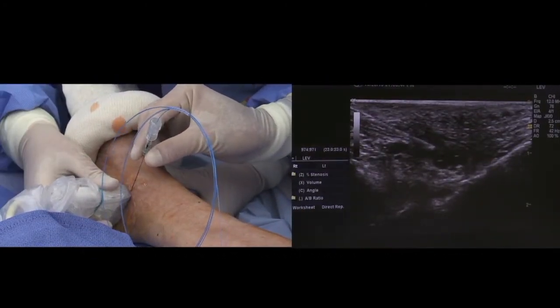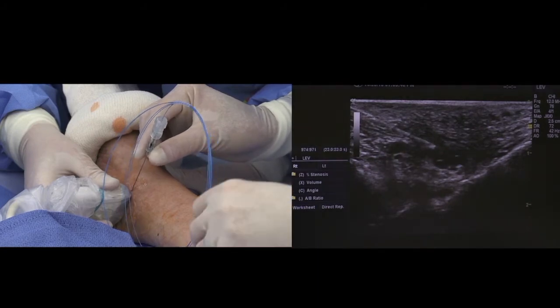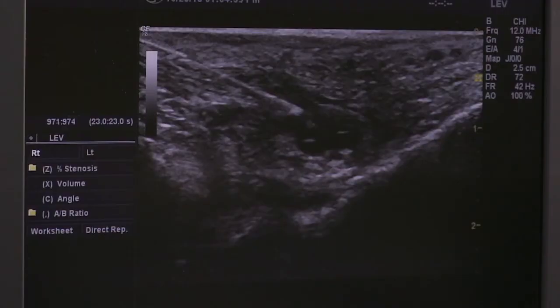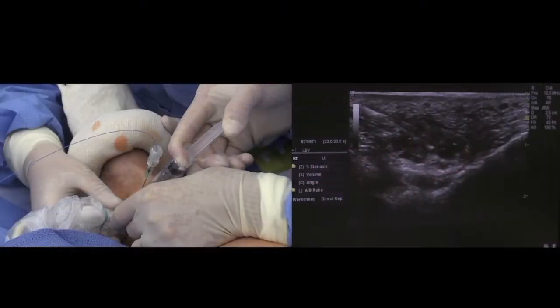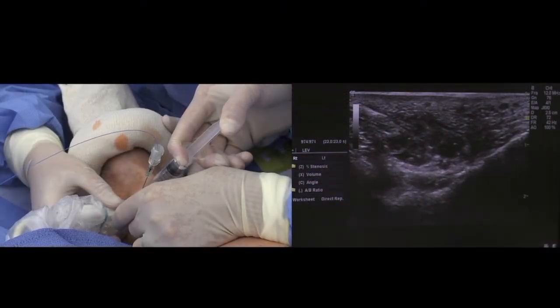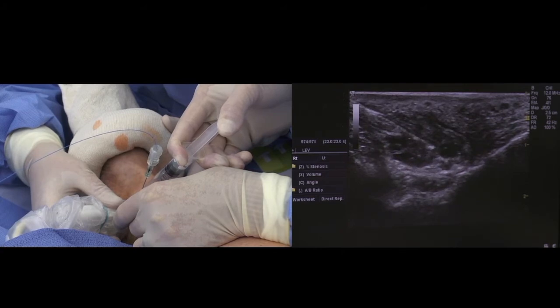So now that we have the needle and fiber in place in this short perforator — you can see the tip of the needle up higher — this helps to compress the vein as well as anesthetize the patient.